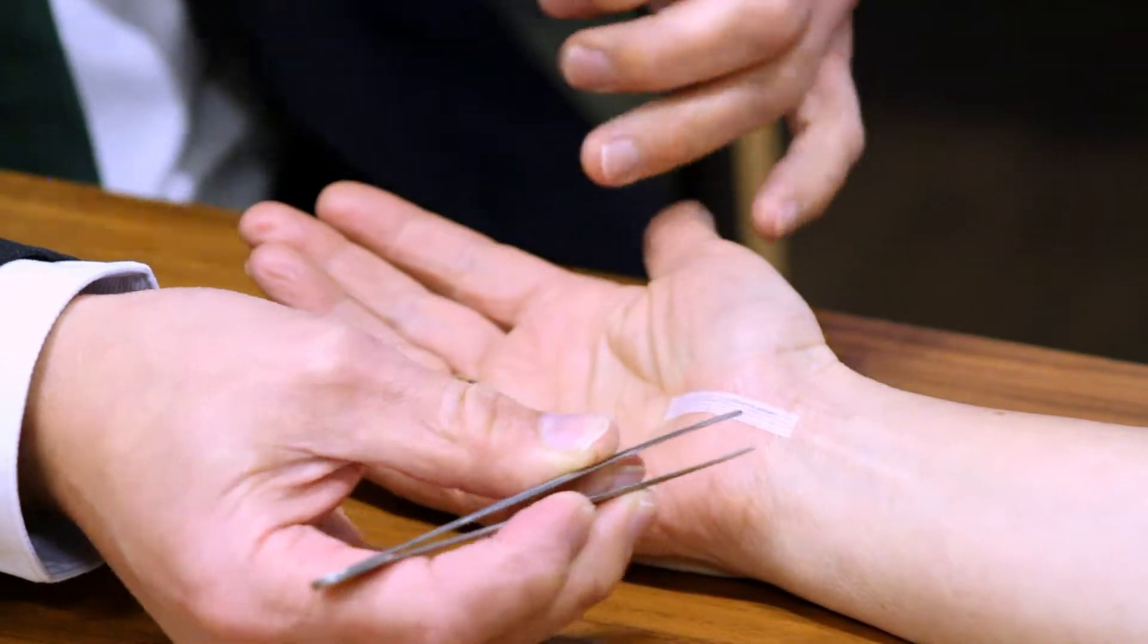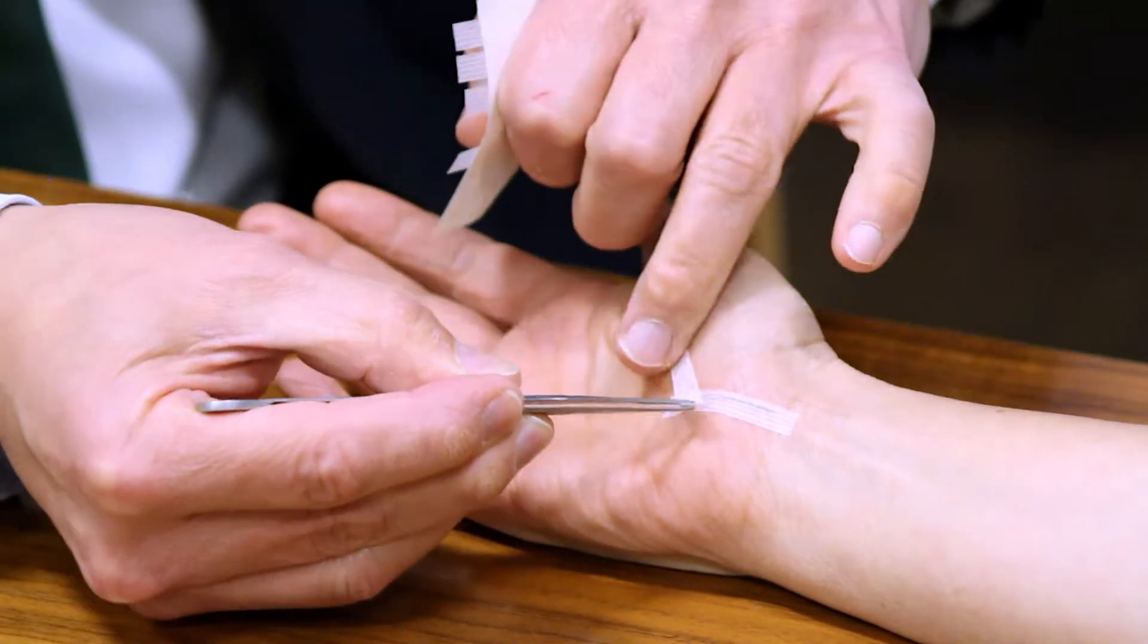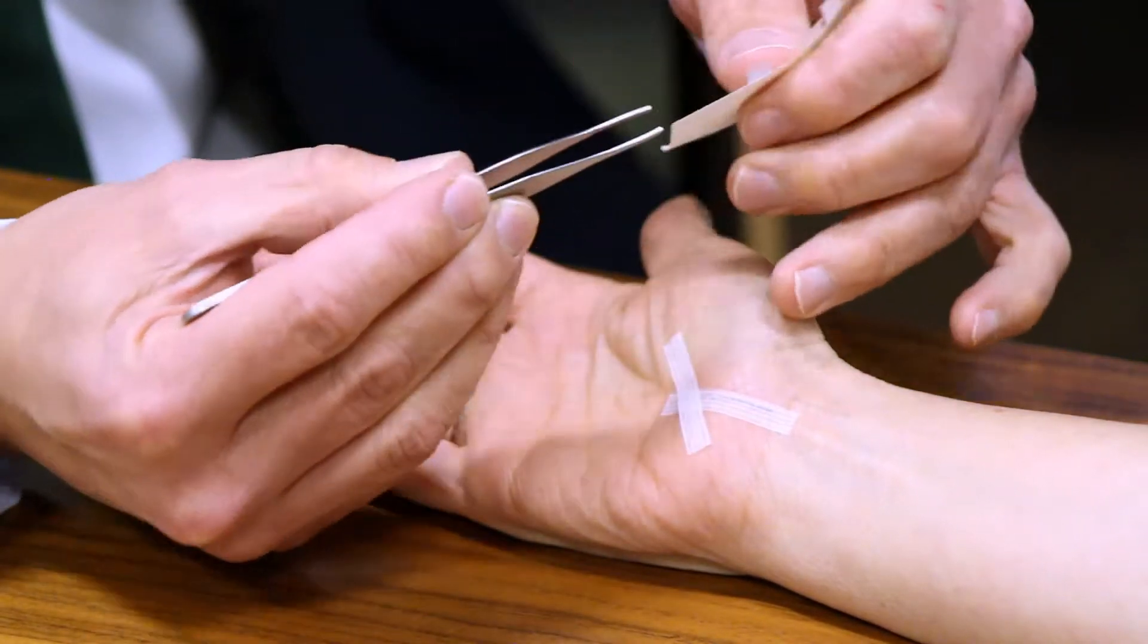And I usually lay a strip along the wound like that to prevent it bleeding. And then we put this across usually obliquely. These are little Steri-strips that we put across here like this.